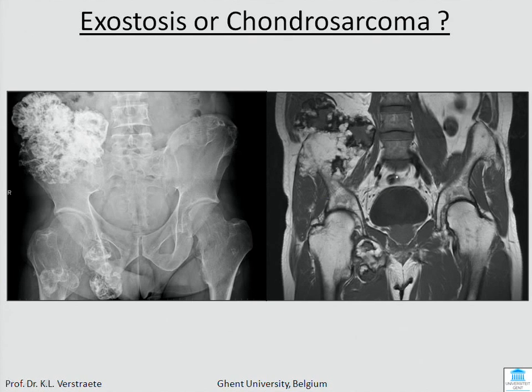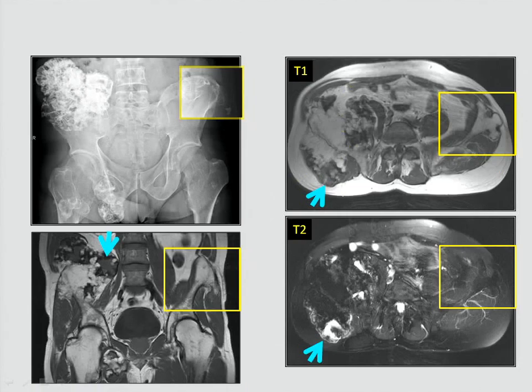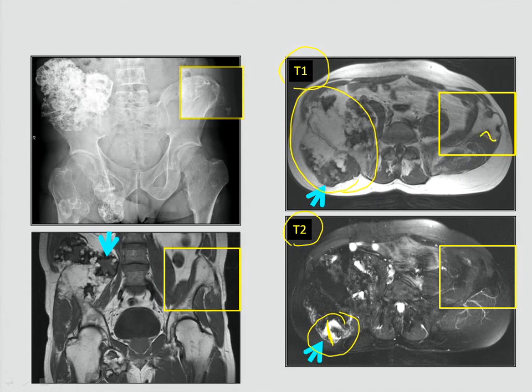Here we have a T1 weighted image, and you see the osseous part of the lesion. When we look on T2 images — we have T1 and T2 — you should look at the lesion. Here we see a thick cartilaginous cap which is more than 2.5 centimeters, so this part of the tumor is malignant. When we look at the other part, you see the bony component and there is no white cap — so this is exostosis, this is not malignant.